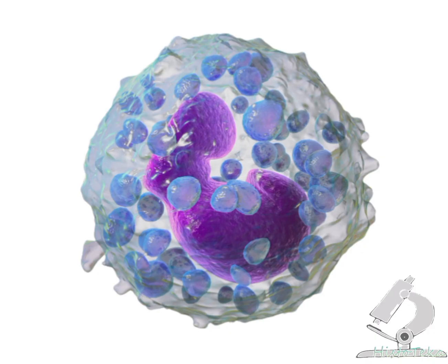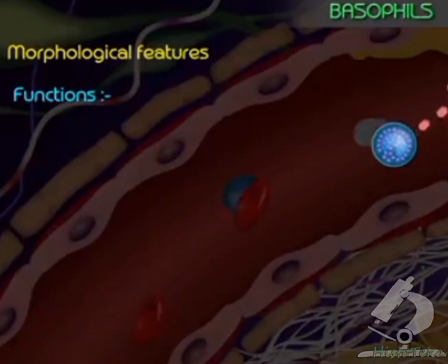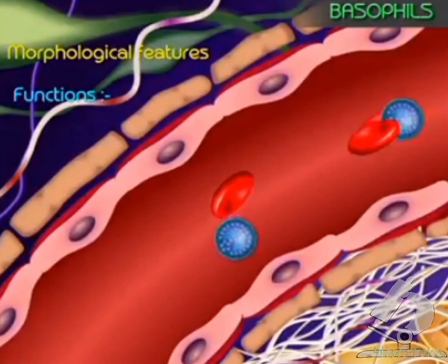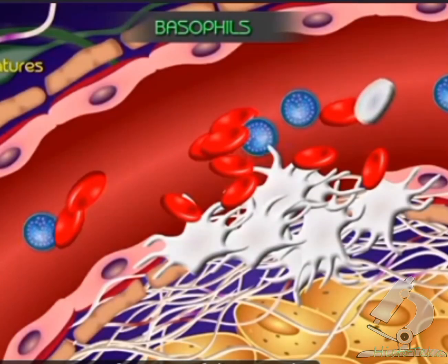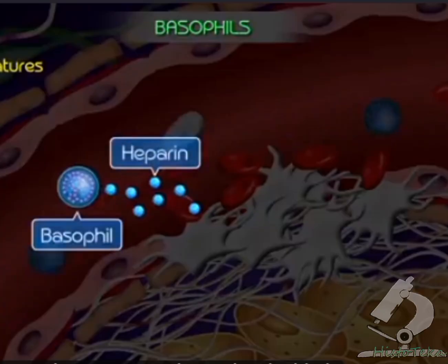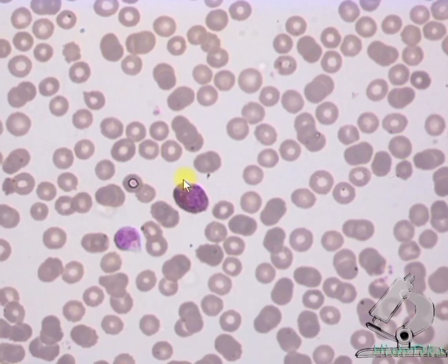Local inflammatory allergic reaction is determined by the release of histamine under the influence of antigen binding to basophil receptors. At the same time, histamine expands the lumen of the vessels and increases the permeability of the capillary wall, and blood plasma begins to flow outside the vessel. In turn, this leads to a slowdown in blood flow and an increase in blood viscosity, which contributes to thrombosis. To prevent thrombosis, heparin, an anticoagulant, is released. The size of basophils can exceed the diameter of erythrocytes by 1.5 to 2 times.